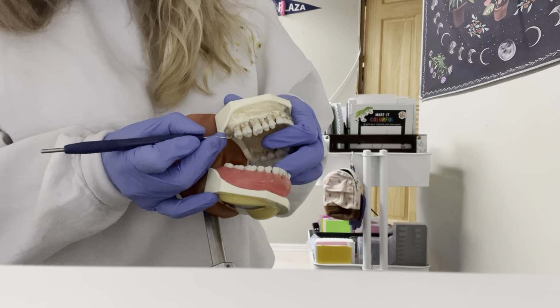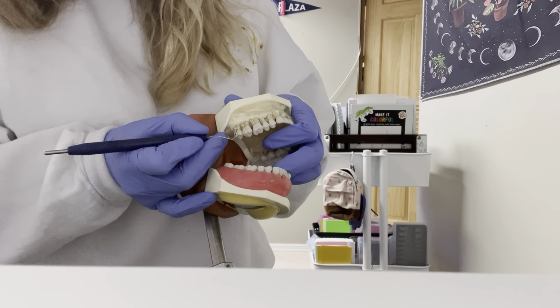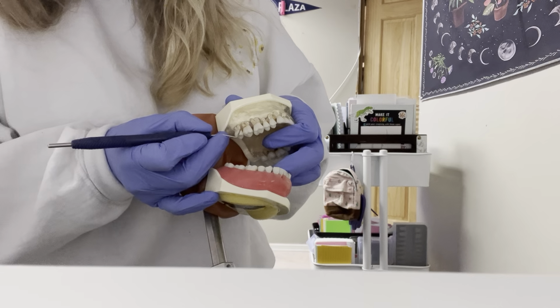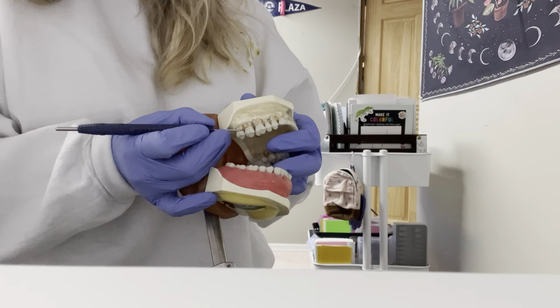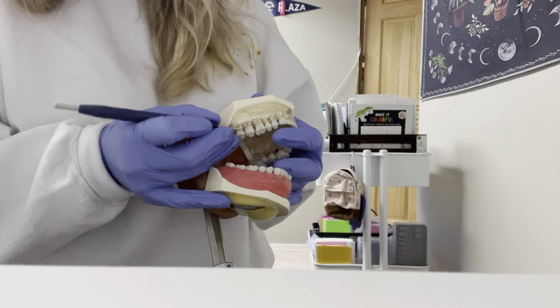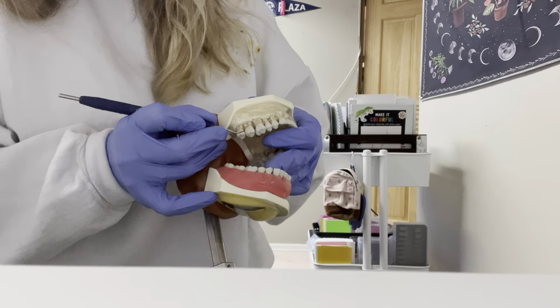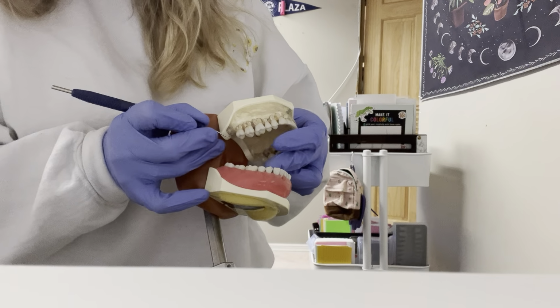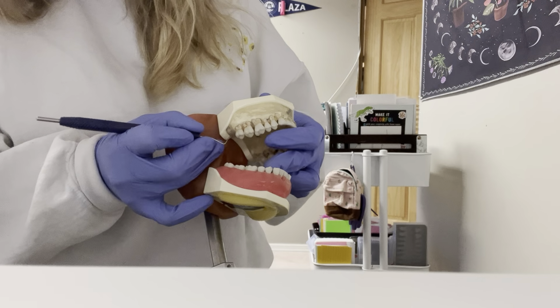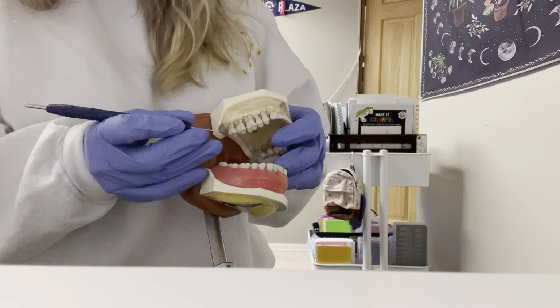Then you're going to walk back to get to the middle. Then you're going to walk to the mesial. And again, you're going to end on a slight angle. For each tooth, you're going to get 6 readings. You're going to get distal, facial, and mesial, and then you're going to get 3 on the palatal or the lingual surface.